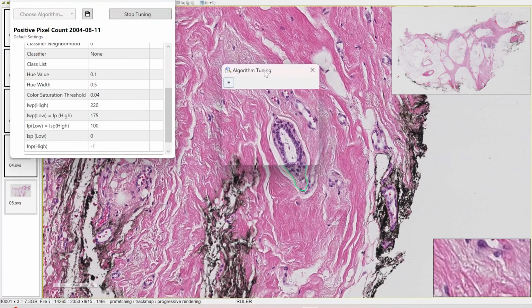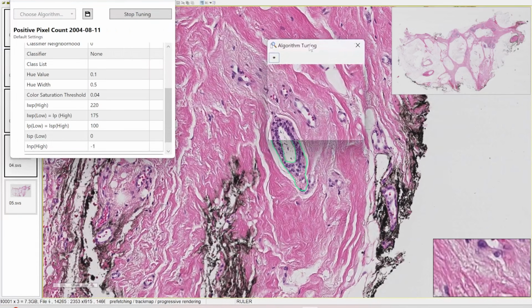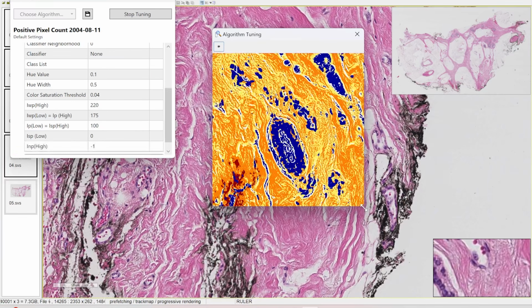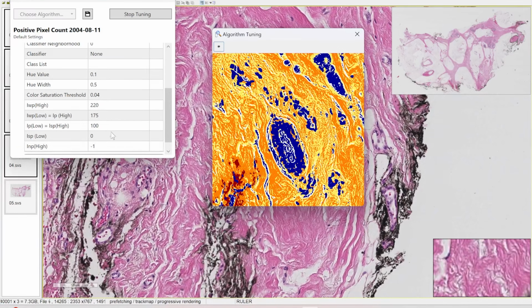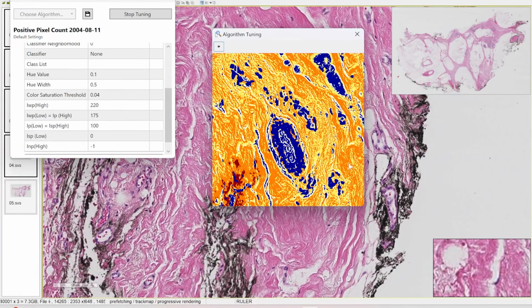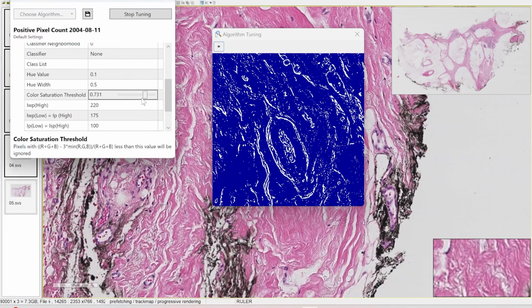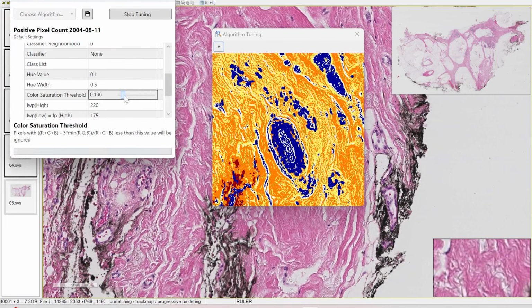by simply using this window and putting it in a specific region. You can also enlarge that region and play with the different configurations, and based on these configurations, the region you are selecting or viewing currently will be updated. For example, if we have increased the saturation, you will see that most of the region converted to blue. Let's decrease it to, for example, that value.